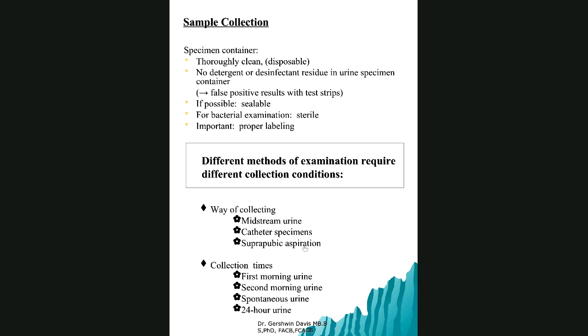I was mentioning midstream. For midstream urine, the time you say midstream, you should be thinking clean catch. That's why the first thing you do for midstream is clean the area. So you demonstrate you know the purpose of doing this particular type of collection. You clean the area first, and that helps you get a clean catch specimen. Then you pass the first bit of the urine and discard, and then you collect the middle of the stream. Midstream urine is for MSU for CS, culture and sensitivity. You want to be able to do a culture, so you want to get as clean a specimen as possible. So that's what's important about midstream urine.